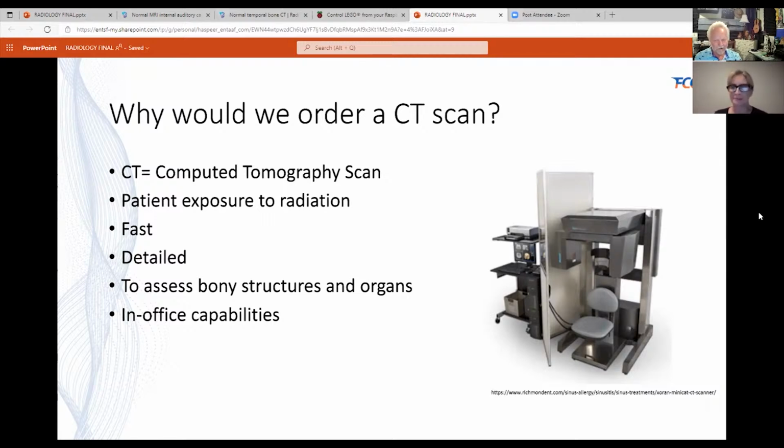It's pretty easy. Right. With a CT scan, to have a patient schedule one, leave the office, go get it done, it's another visit. They have to go to the scan unit, wherever that might be, and then come back, have us review it. Instead, it literally is a 5-minute thing. They walk down the hall, sit down. The technician is able to input the information about the patient, hit the scan button, and the scan takes maybe 15, 20 seconds. And the patient's done. I can come over, take a look at the images. The patient is whisked off to audiology if they haven't already had that done. And then I can present everything that we found all in one visit. So it's really great value for everybody concerned.